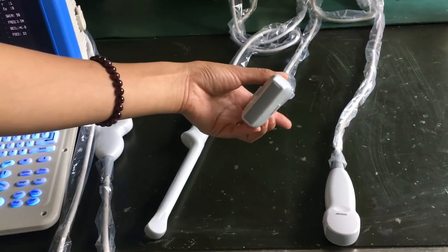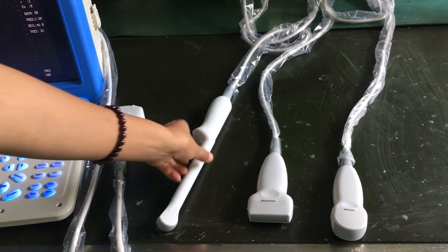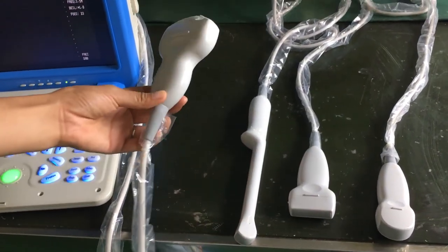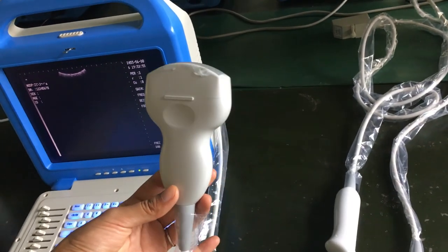The linear probe is for superficial, vascular, bone, and muscle use. The transvaginal probe is for obstetrics and gynecology use. The convex array probe is for normal functions such as abdomen examination.